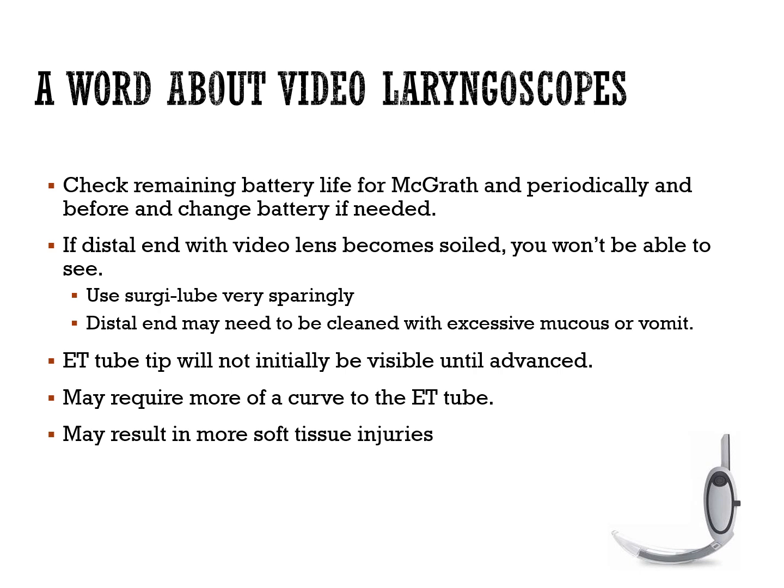Conceivably, you could use it as an old-fashioned type. The problem is that when the battery goes, you no longer have a light source either. So it's not about just using the video feature. It's much more than that.